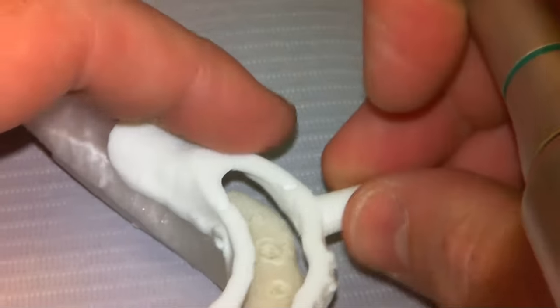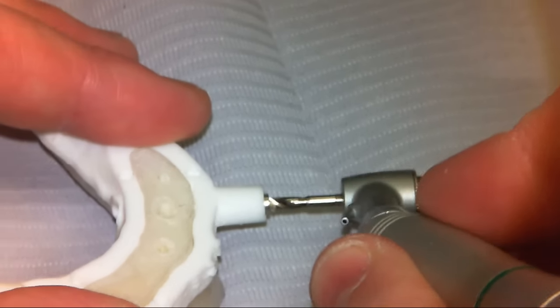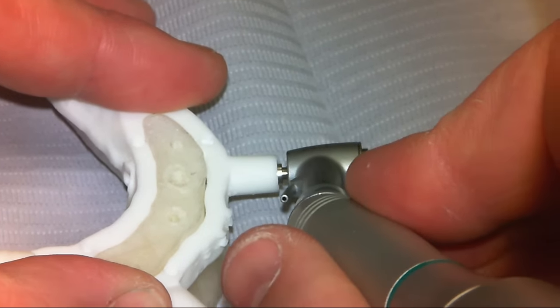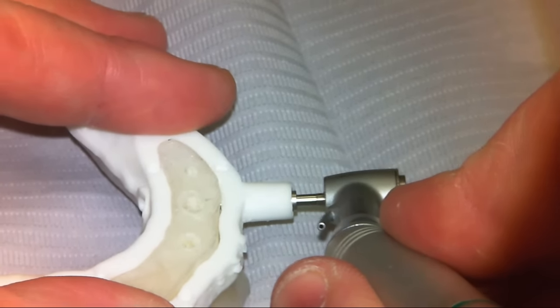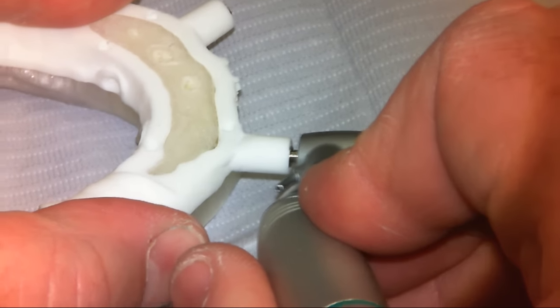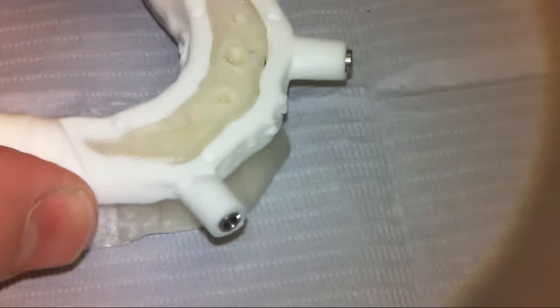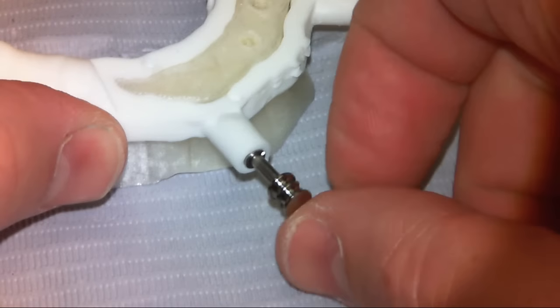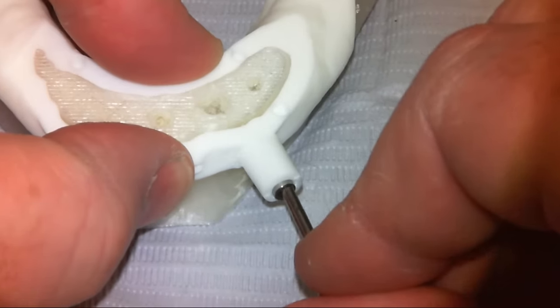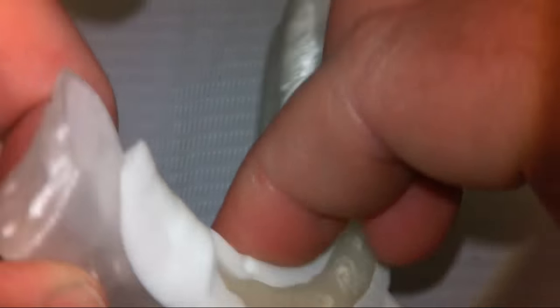This was printed out with the drill holes where they needed to be. To do the pins, I'm going to go in until I sink up against that ring, then come and do the second one. That's the placement of the pins. You'll follow up and actually put the pins in and press them into place until they bottom out.